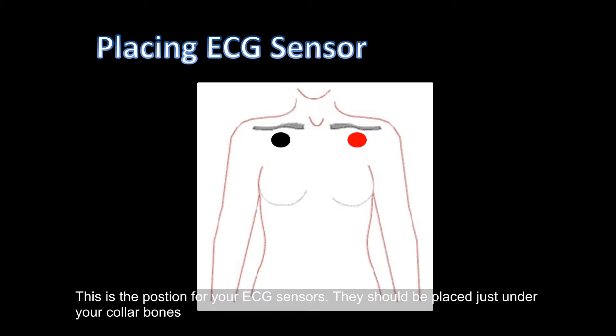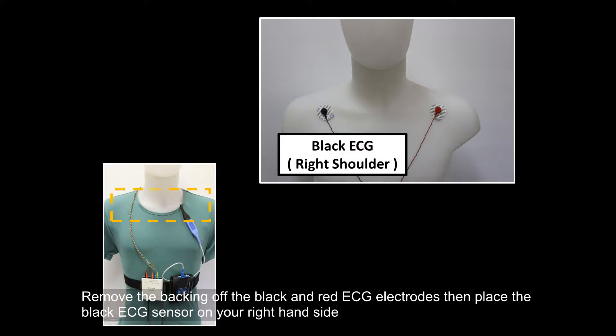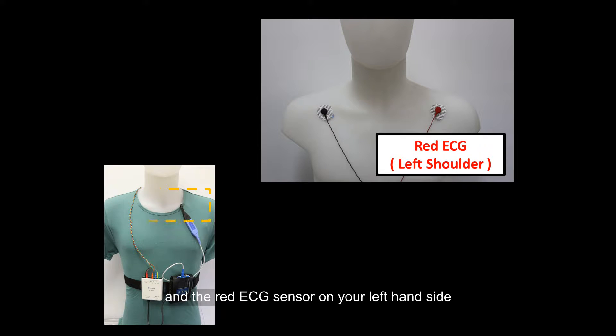This is the position for your ECG sensors — they should be placed just under your collar bones. Remove the backing of the black and red ECG electrodes, then place the black ECG sensor on your right-hand side and the red ECG sensor on your left-hand side.